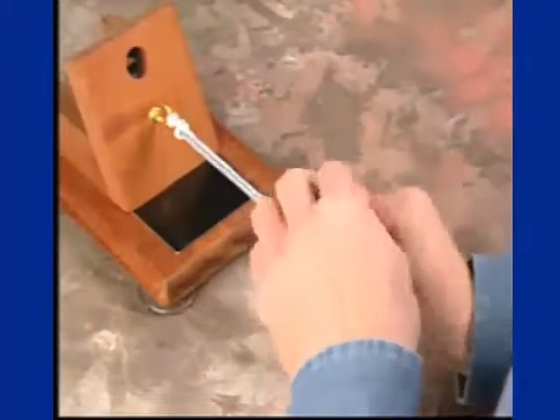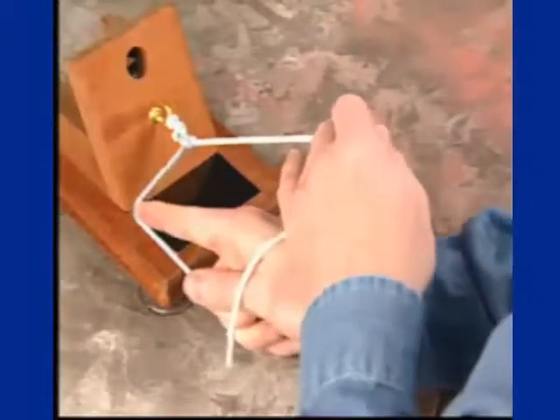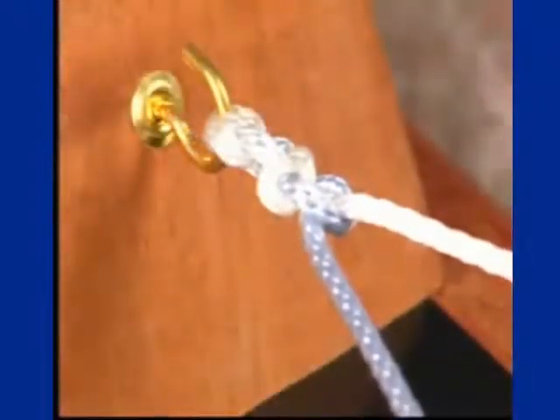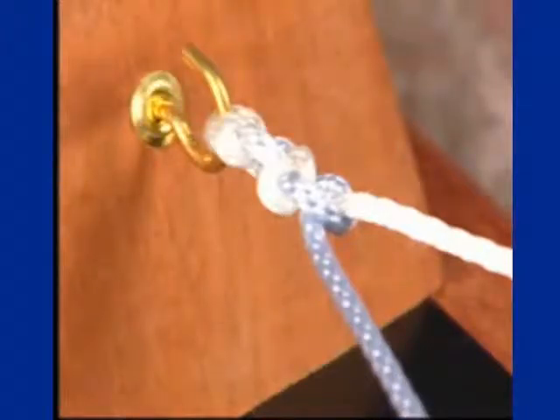Three half hitches allow for good security. The demonstration here shows further half hitches, emphasizing the point of alternating posts while alternating the throws of half hitches, demonstrating good half hitch knot tying.